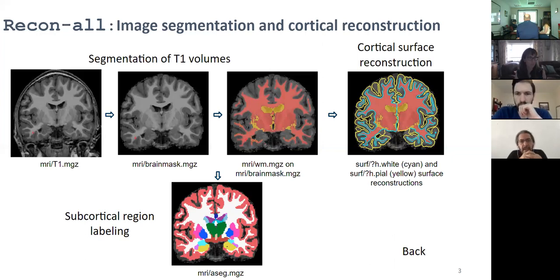Right, because if they go to the multispectral future and deal with the deformation between the functional and structural, that would be a huge advantage for us, at least. For many analyses, people use FreeSurfer just for structural analysis and don't care about the functional at all. But for our analysis, we care about this whole mapping between the two. Well, I would say that may be a bias, a speech lab bias there.